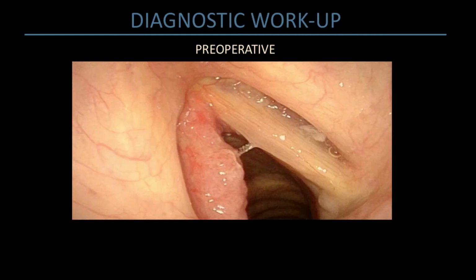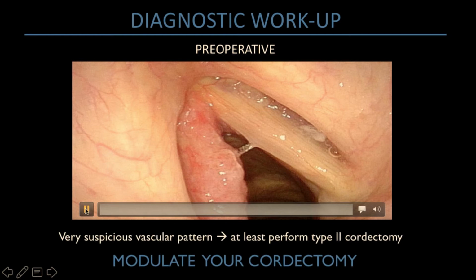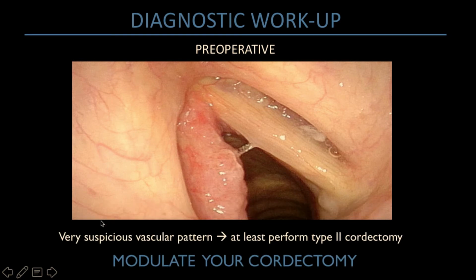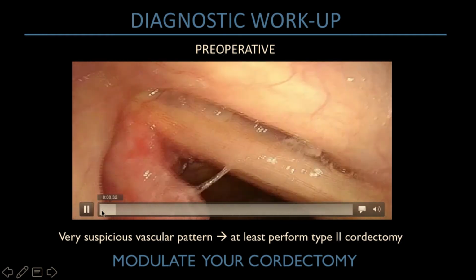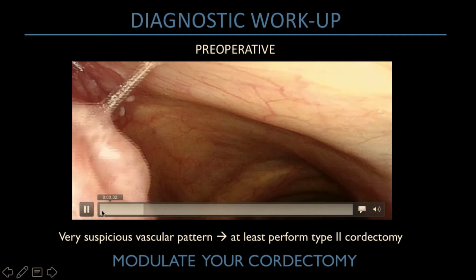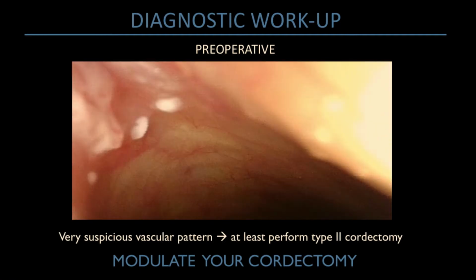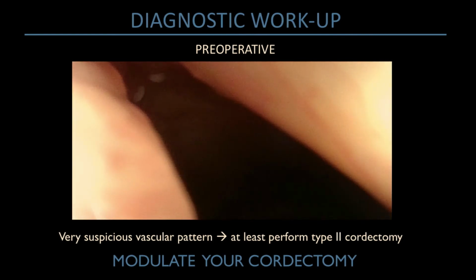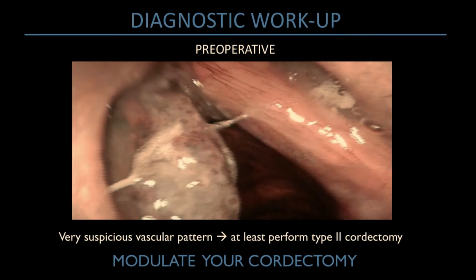This is an example of untreated erythroplakia. It raised suspicion in the office, so we put the patient in the OR. You can appreciate the difference between the two vocal cords. With a 70-degree telescope, you can scope the subglottis and the anterior commissure very well. The 70-degree is very useful.